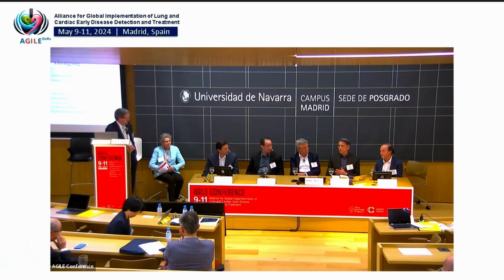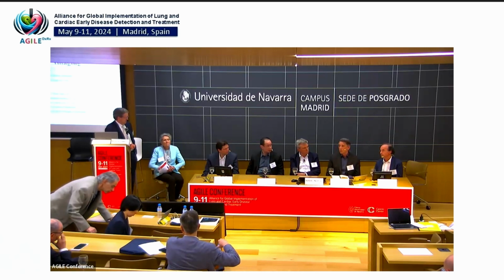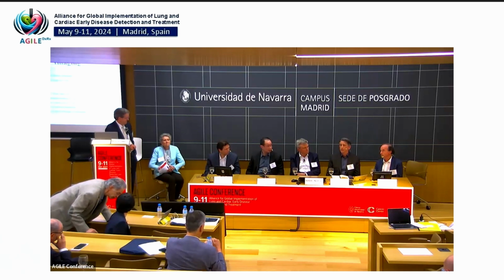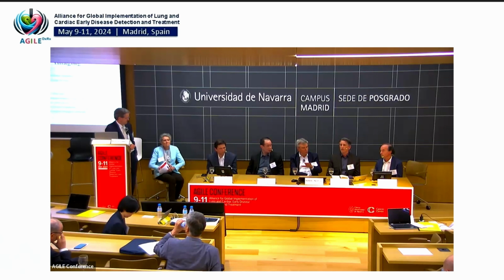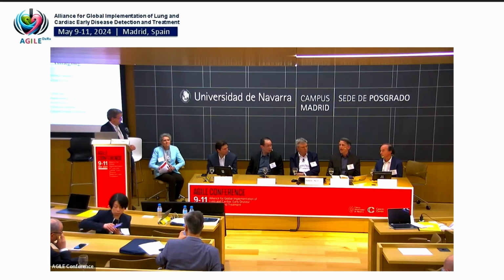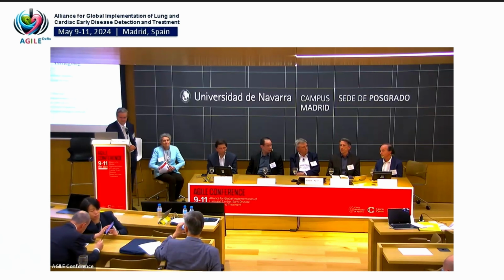There are some things, though, from the point of view of quantification of emphysema that I think are absolutely critical, that may or may not be well controlled in the current lung cancer screening approach. The most important source of variability is inflation state of the lung. If coaching is not being done in a consistent way to achieve the breath hold, then you're going to get a lot of variability.